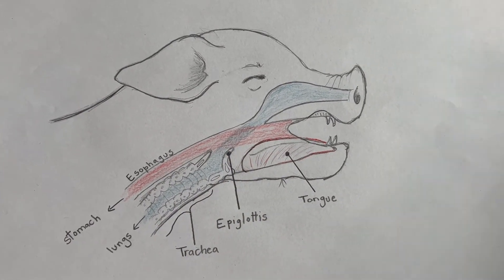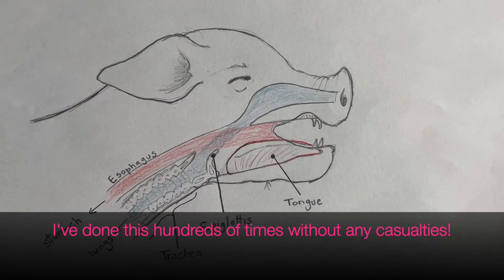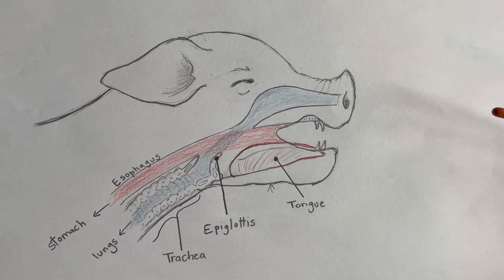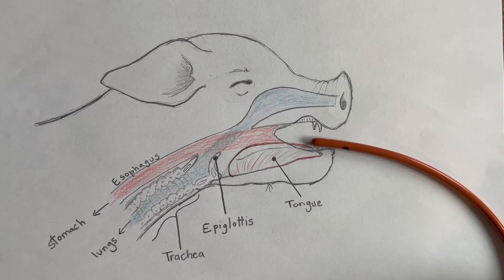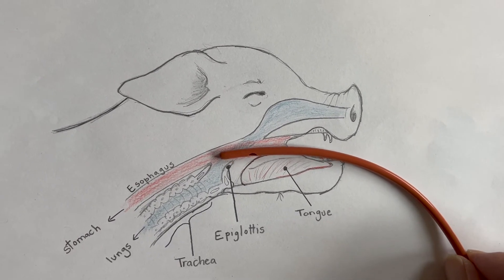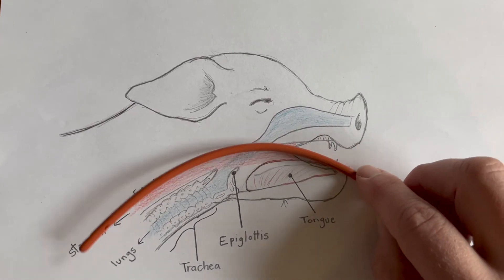When we pass a feeding tube you can feel fairly confident. Worst case, unfortunately, you drown the baby animal with food — but most likely, if you stretch the head up and open this area, you'll end up in the right spot. You can do this with piglets, baby goats, or lambs. Our goal is to put the tube in the groove of the cheek and let it slide down. As you get to this point, the baby animal will start to swallow, using that motion to guide the tube down the esophagus.